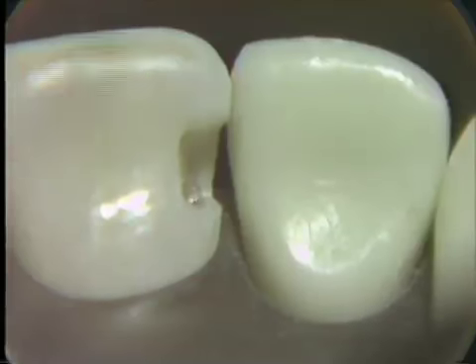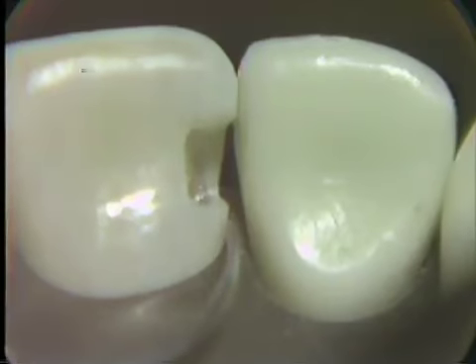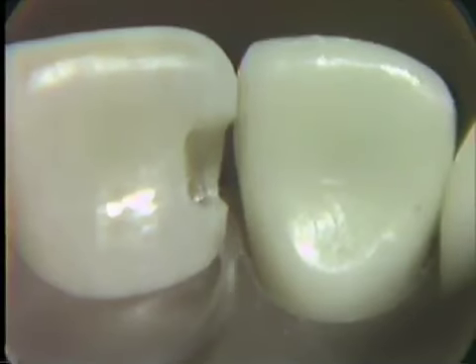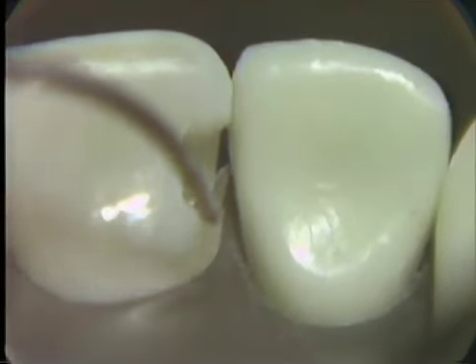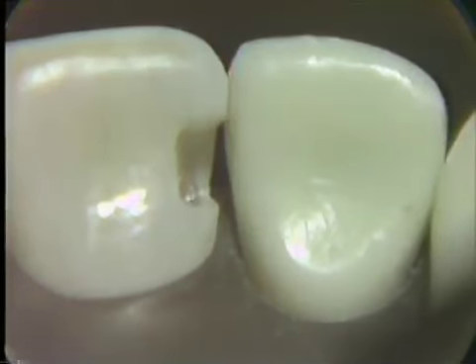Looking at the tooth again, as we view this, there is absence of decalcification in the cervical area. We've cleared the carious lesion in its cervical and incisal position. There is still contact in the incisal area to some extent. The external outline form does provide convenience for us, and there's somewhat of a triangular shape to the cavity preparation with a good opening so that there is convenience in the condensation of the restorative material.